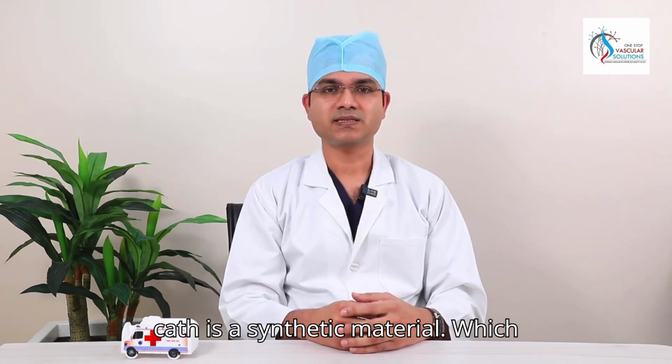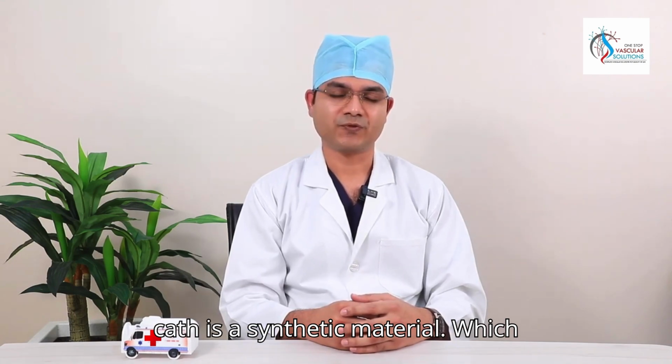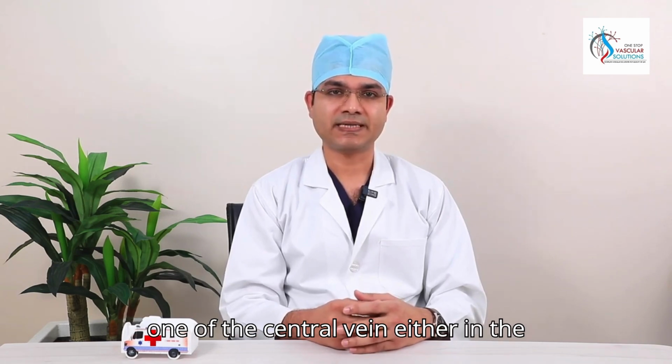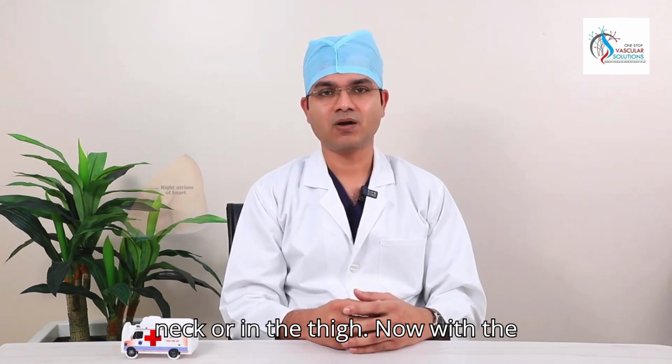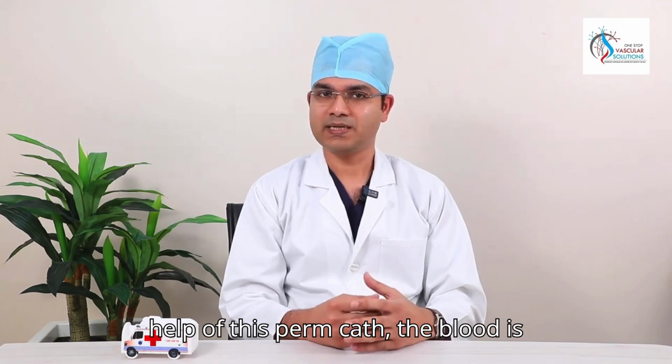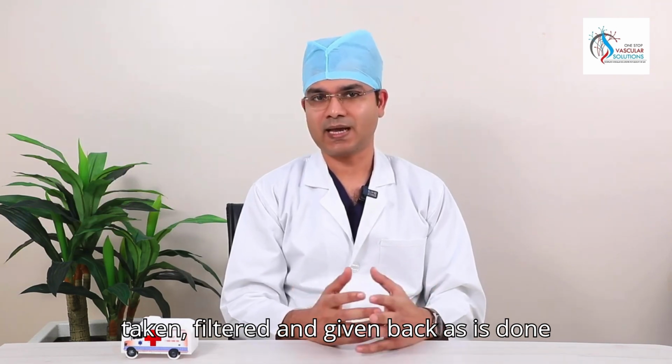Now let's start with perm cath. Perm cath is a synthetic material in the form of a tube which is kept in one of the central veins, either in the neck or in the thigh. With the help of this perm cath, the blood is taken, filtered and given back, as is done in any dialysis.